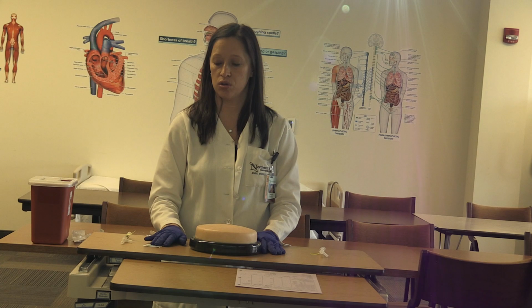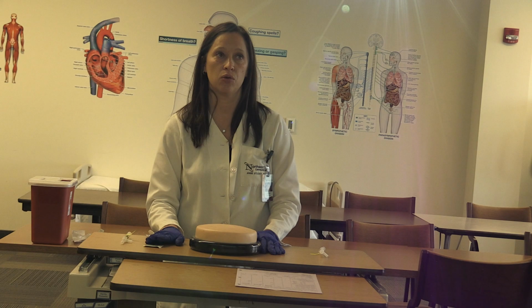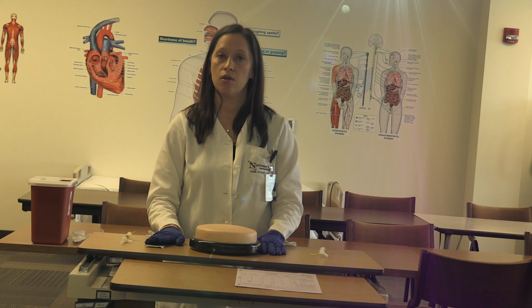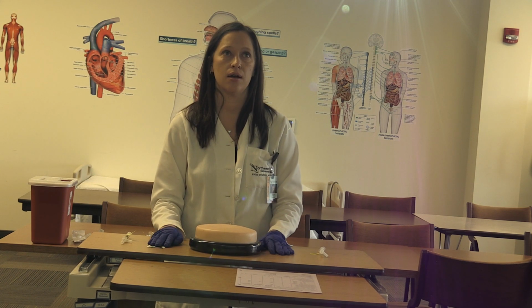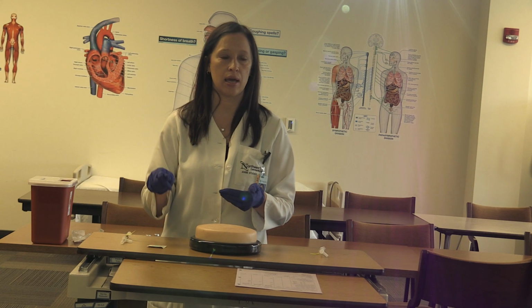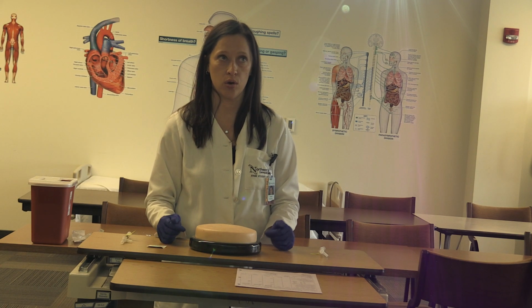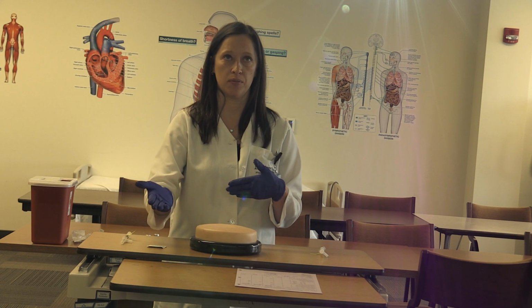And then we're going to note the 6 rights of medication administration. So that would be the right dose, the right route, the right time, the right individual, the right medication, and then of course documentation. Because if you don't document, then it wasn't done. So at this point, going into the patient's room, you'll do your 3rd med check. So this is when you would, if you have computer charting, scan your patient's badge, scan the medication, and then scan your own badge. So you do your 3rd med check, compare the medications with the patient's wristband and the MAR.